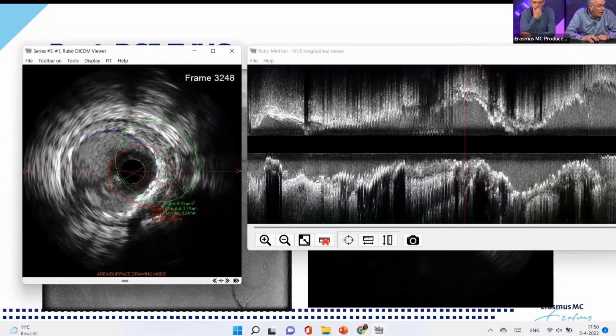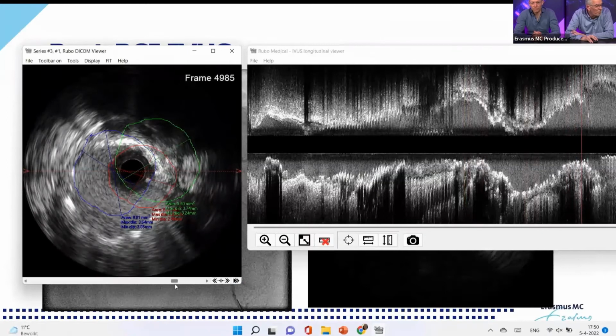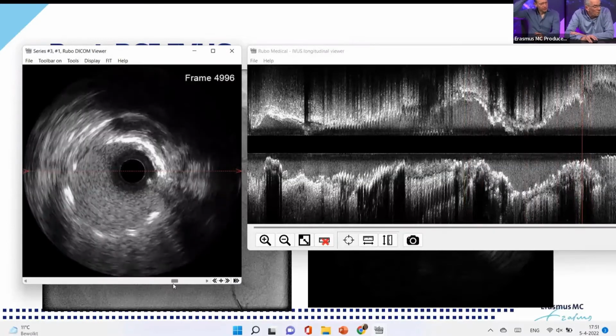Now it takes blue. I cannot choose the colors, which is good, I think. There also I have, oh dear, around 9 square millimeters. So what you want is a stent that is approximately 90% expanded, but in this case there's no discussion that this stent was definitely underexpanded. If we go proximal, the stent is placed over the circumflex. And this is critical.